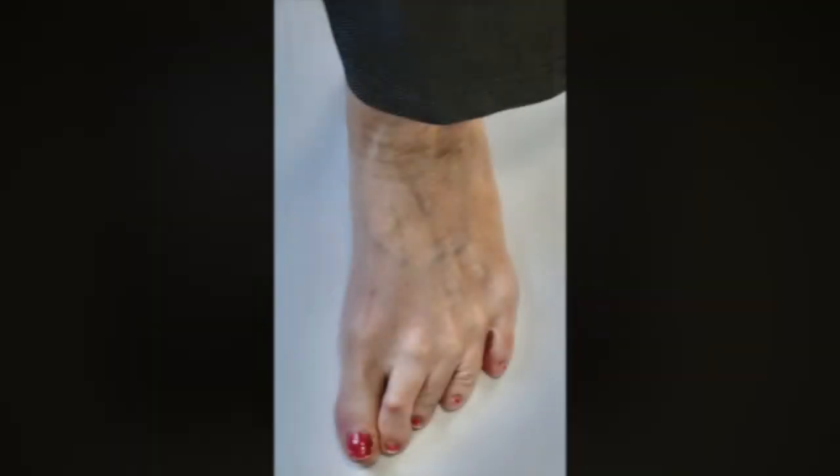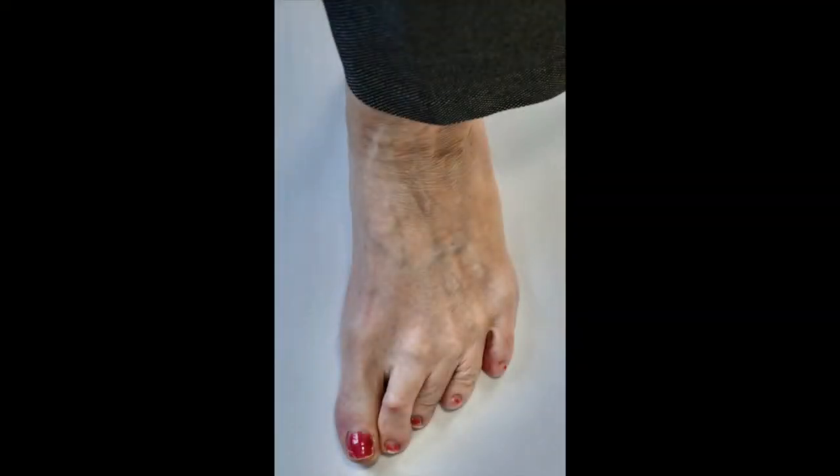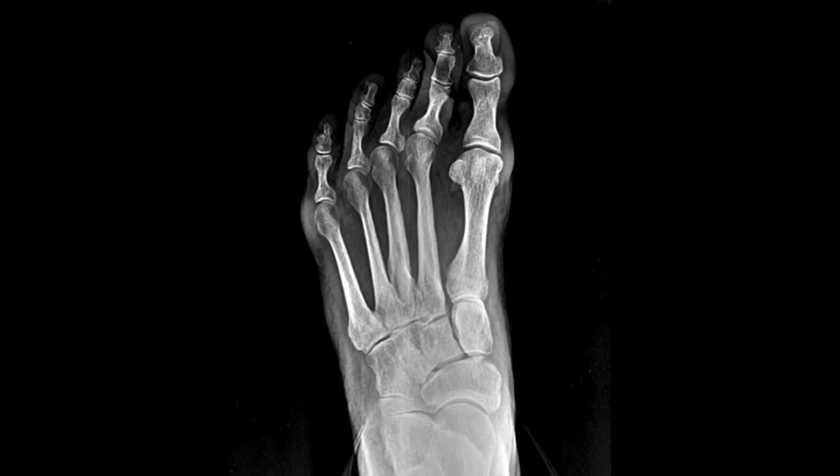Today we're going to show you a correction of transverse hammer toe deformities utilizing minimally invasive surgery, and we'll discuss that while we're talking about the surgery. This patient had fairly significant transverse hammer toe deformities.